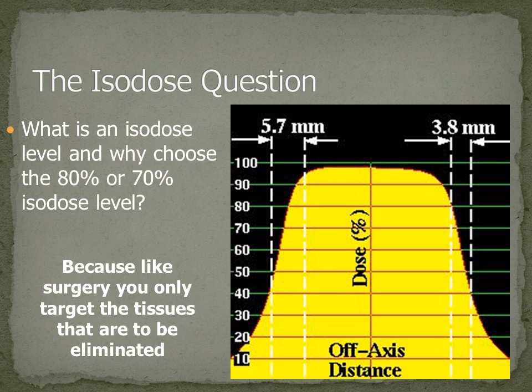I'm now on the steep part of the curve, so I could drop it off much more rapidly. What this means is if I select the right collimator and get the 80%-ish range to sit over the edge of the target, I'll fall off to the minimum dose much more rapidly because I'm prescribing on the edge of this target.